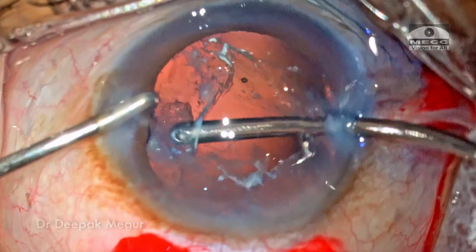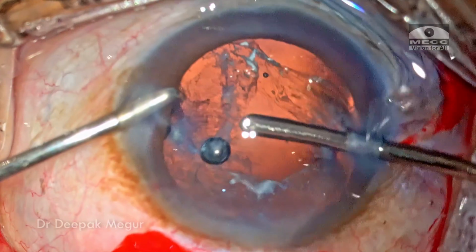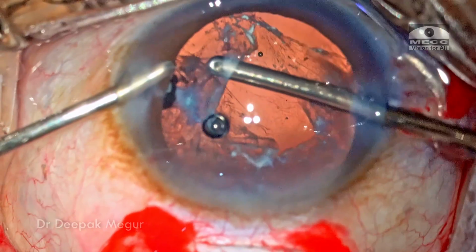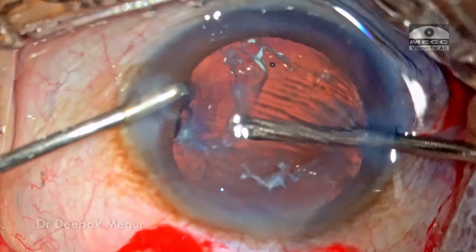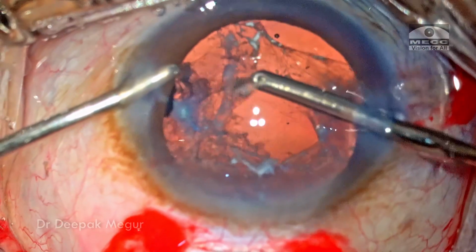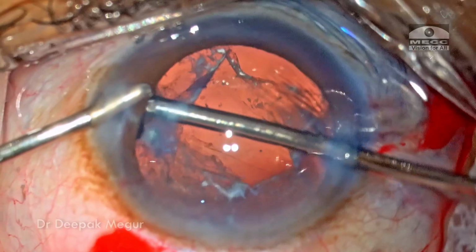I am attempting to aspirate out some of this very sticky cortex using the bimanual irrigation aspiration. The settings are kept extremely low, with very low vacuum and flow rate, so that I don't pull out this very vulnerable bag. So gradually and very carefully, each of these thickened cortical fibers is just teased out.